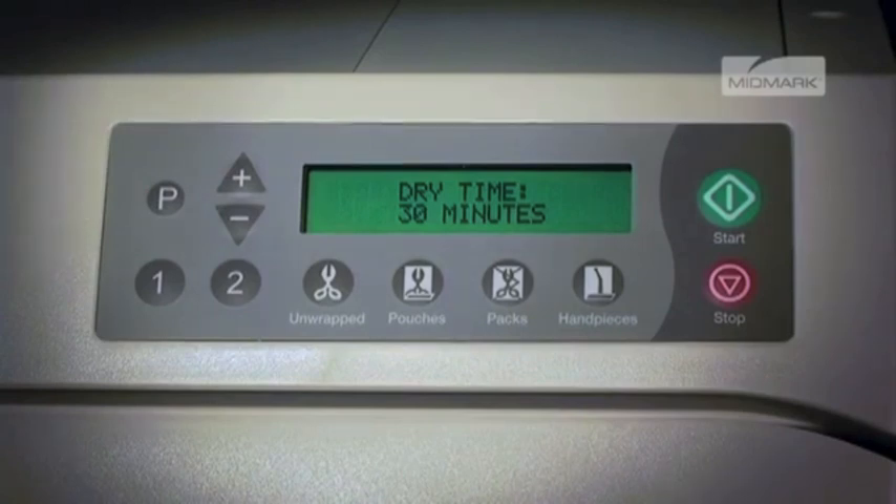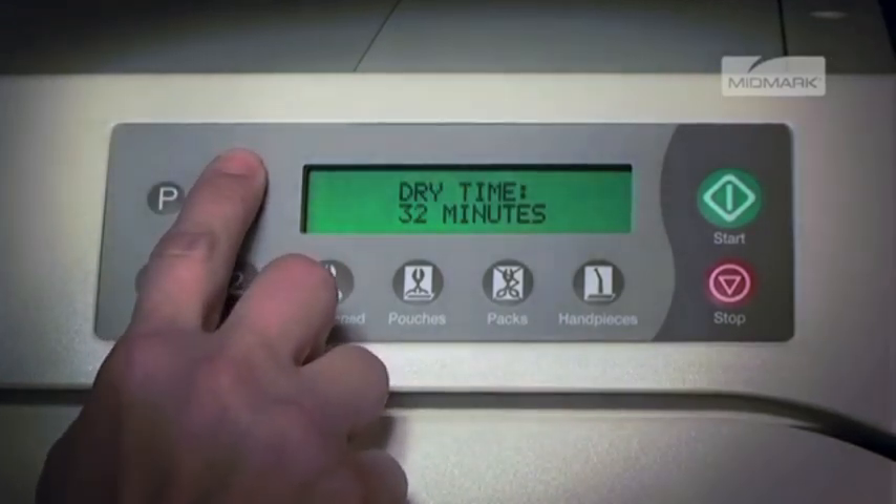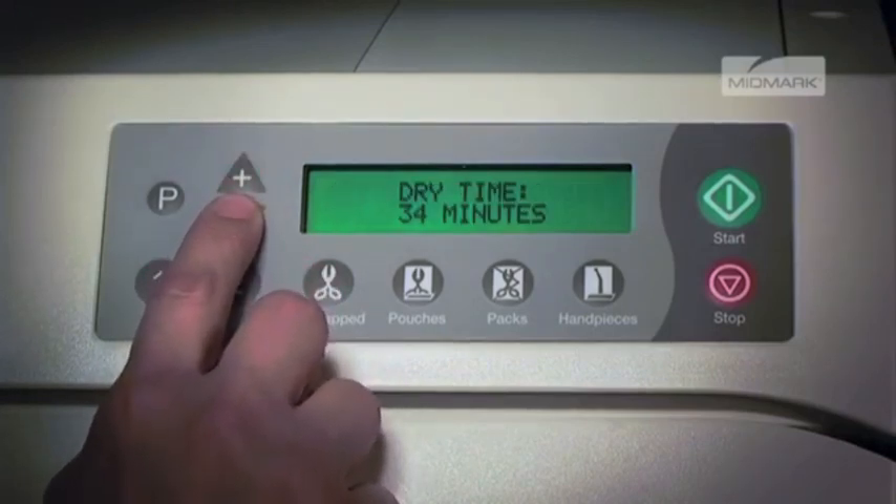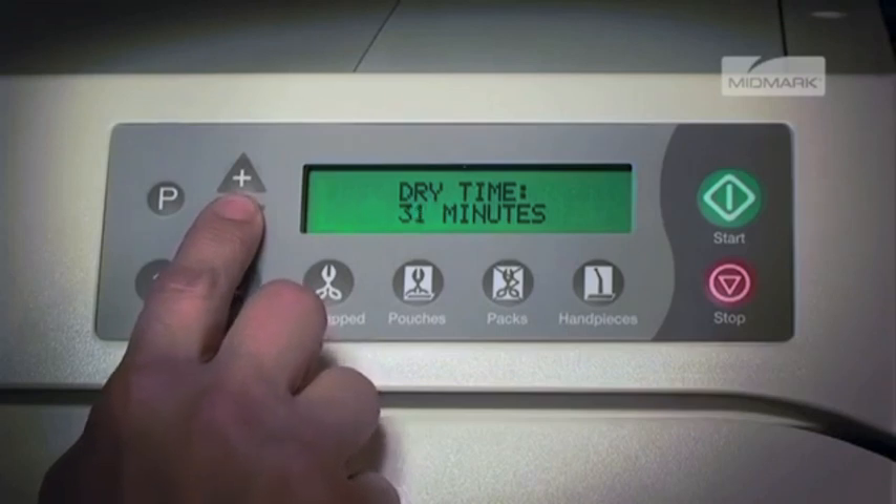The display shows drying time and the current number of minutes. By pushing the plus or minus button, the drying time can be changed in one-minute increments. Dry time can be set from 0 to 60 minutes. Once the desired drying time is displayed, press the P button to store the program.